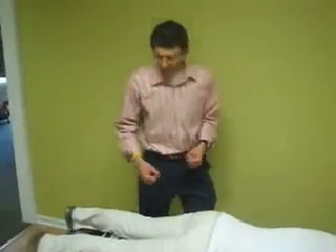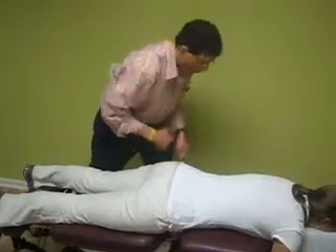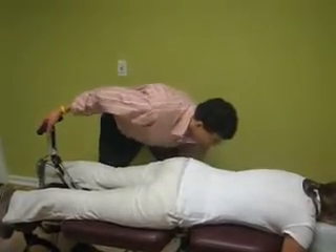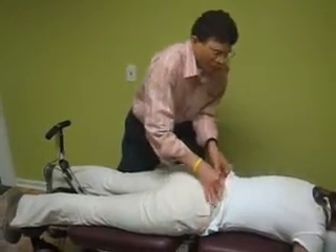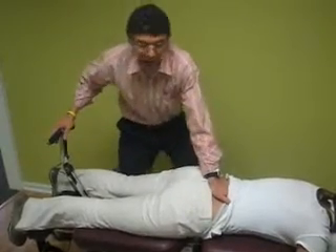This is a very comfortable technique and it is also hands on, very precise, and doctor hands-on controlled. I already have the patient down on a Cox table and we're going to show you the procedure. I am checking the patient to see if they're on the table properly. We're going to bring up the handle, unlock the table — it moves in several different directions — and I am going to locate the lower part of the lumbar spine and take a tissue pull, starting at the fifth lumbar.